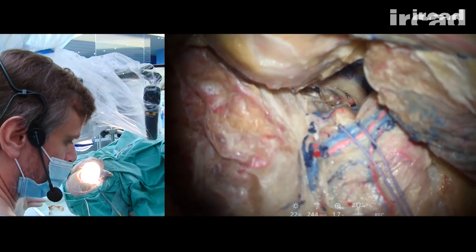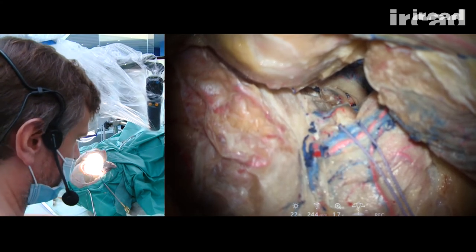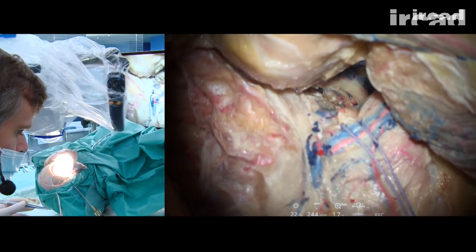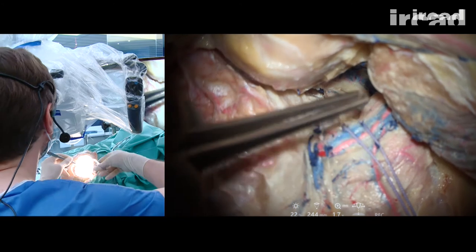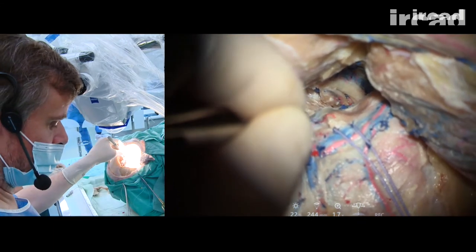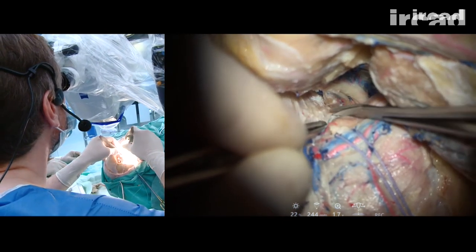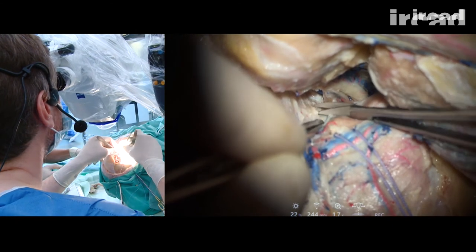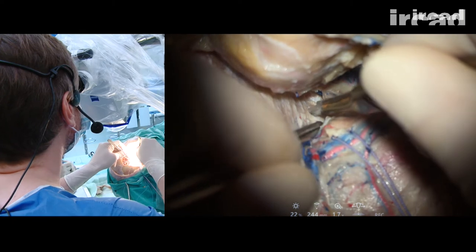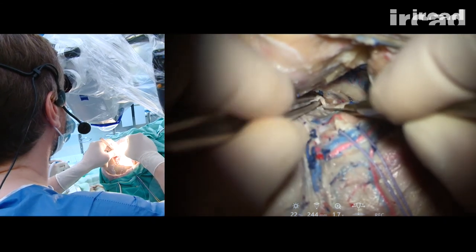Let's open rapidly the dura for you to see, for you to have an idea. The brain is very stiff, so I'm not completely sure we will be able to see much.